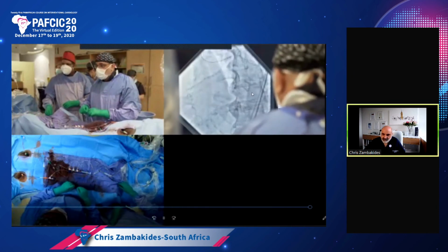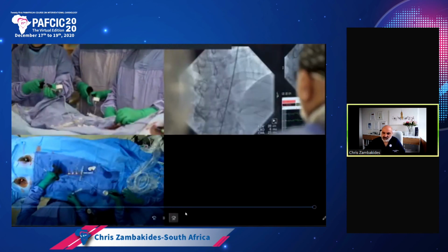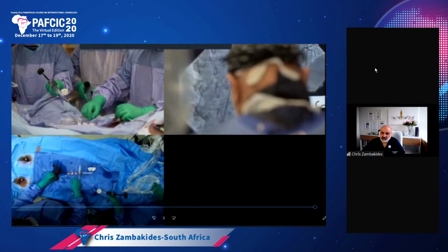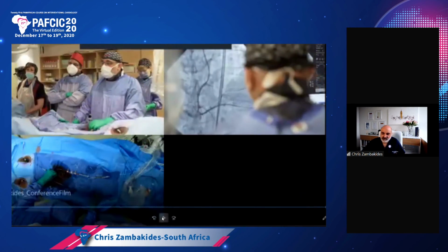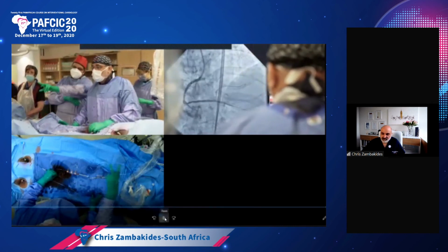There's the wire going into the PLA. Now PTCA, angioplasty in both the branches. And now we're going to do a kiss, so let me just get the two markers. 2 by 20 balloons. I'm just going to go towards the end. But 20 non-compliant. Is that stent overlap?